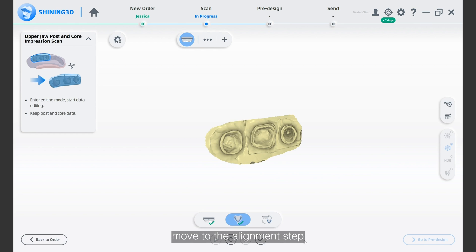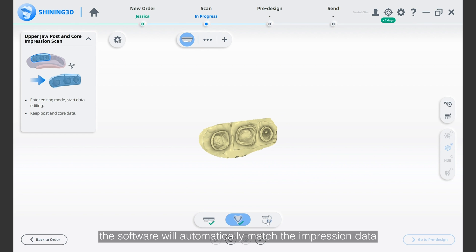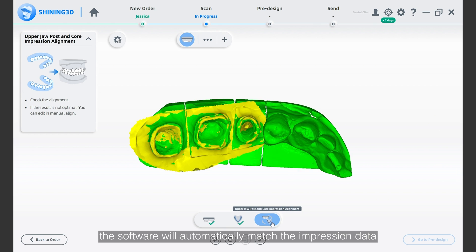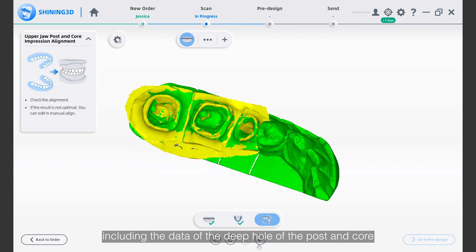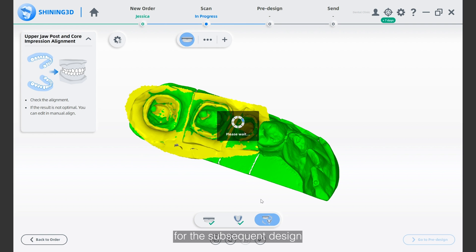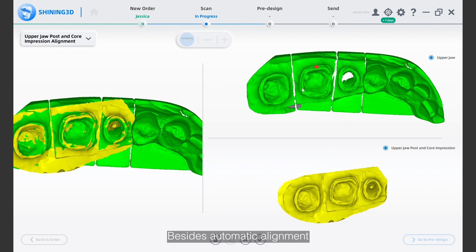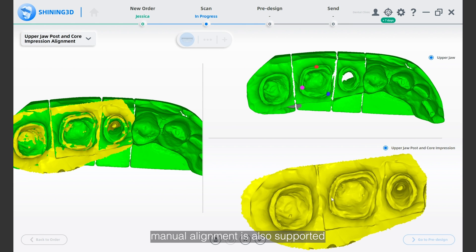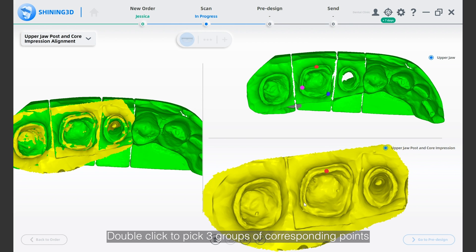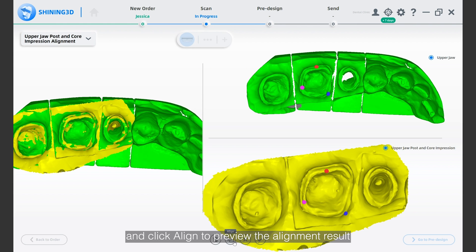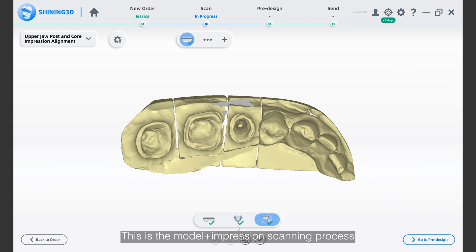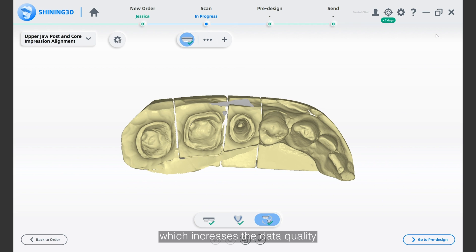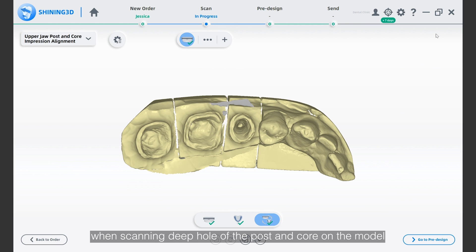After that, move to the alignment step. The software will automatically match the impression data with the plaster model data to obtain complete data, including the data of the deep hole of the post and core for subsequent design. Besides automatic alignment, manual alignment is also supported. Double-click to pick three groups of corresponding points and click align to preview the alignment result. This is the model and impression scanning process, which increases the data quality when scanning the deep hole of the post and core on the model.